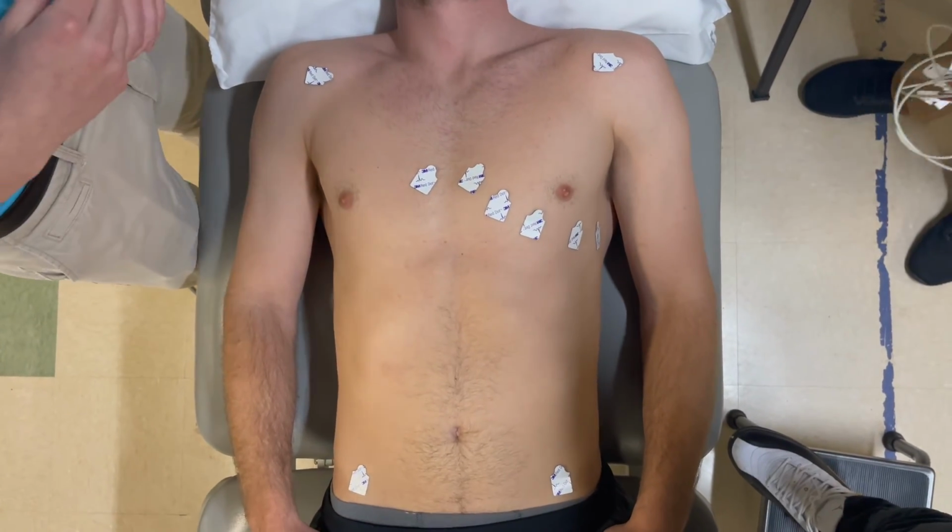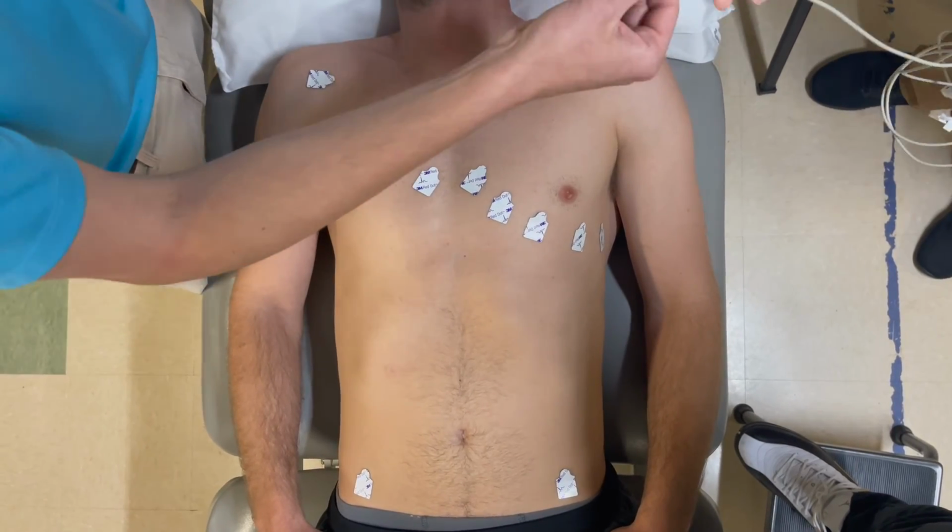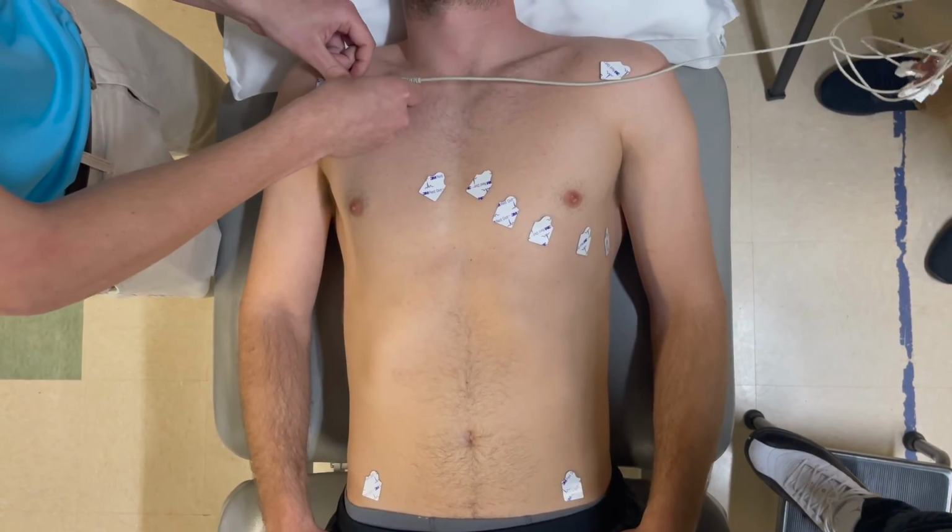For the final part of setting up an ECG, we will connect the leads to their proper electrodes. Each lead should be labeled as shown in this picture.